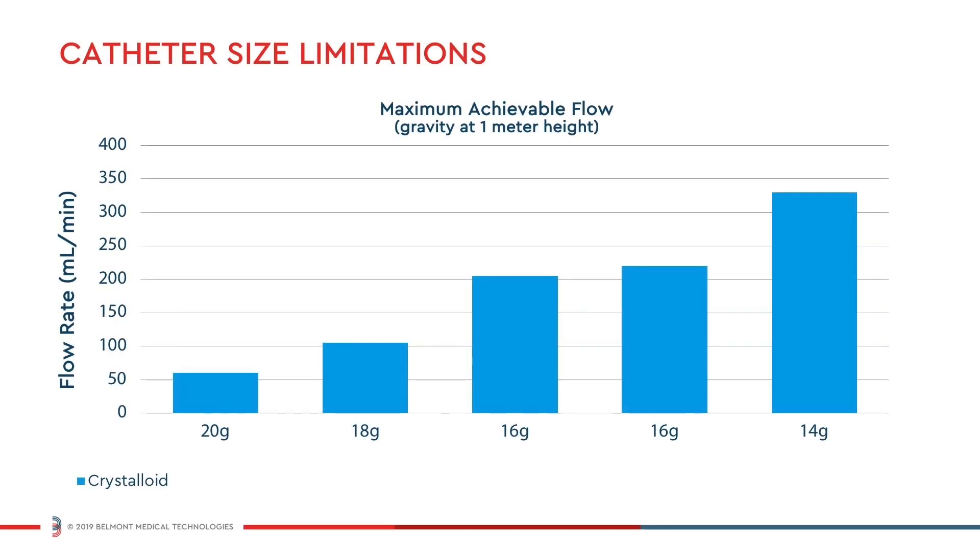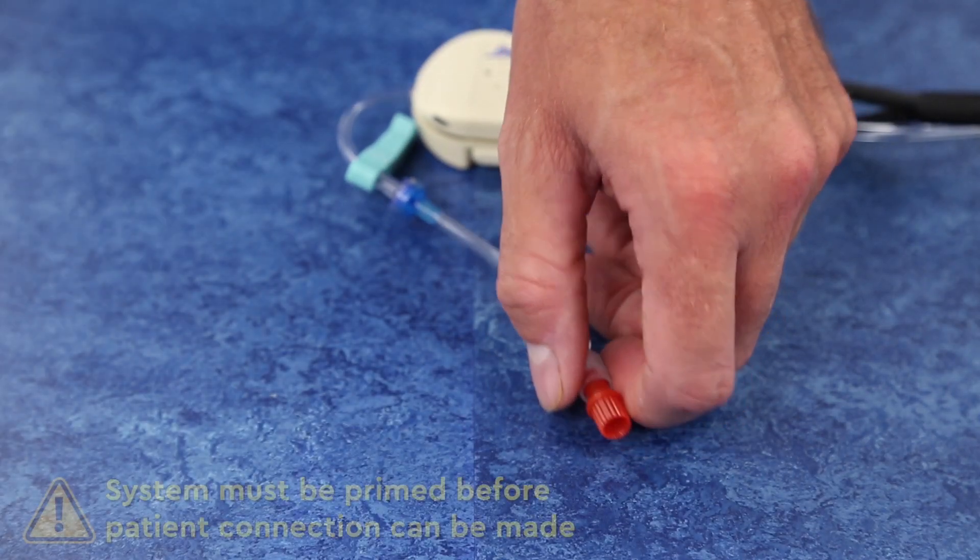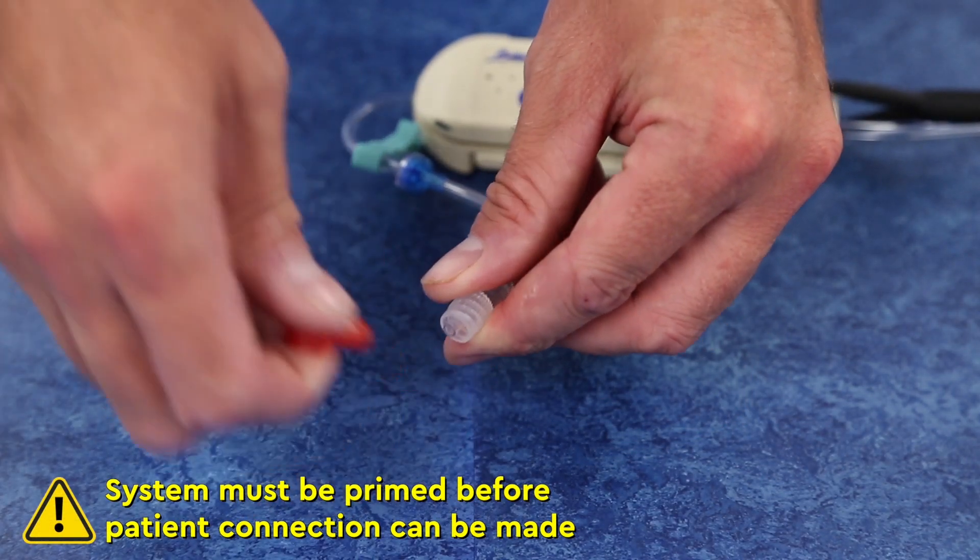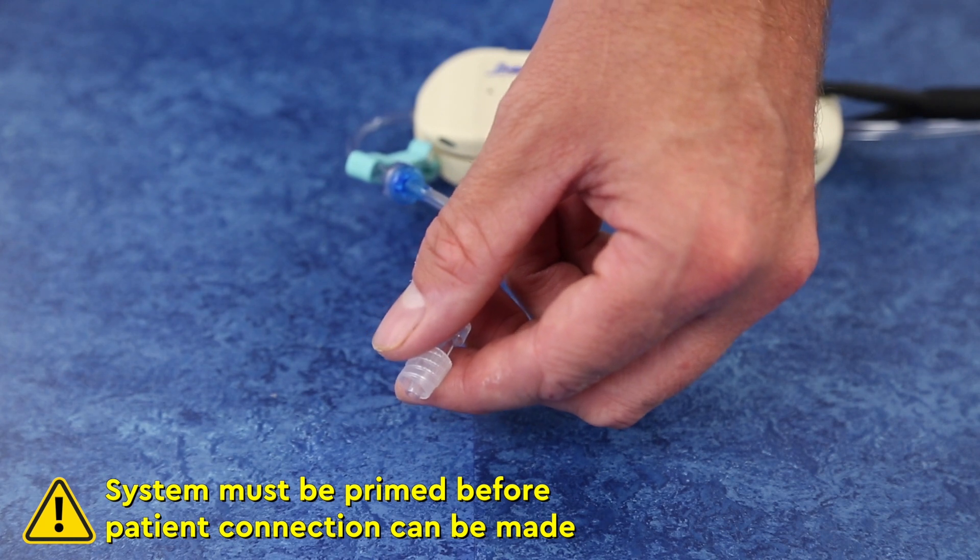To begin operation, first select the appropriate catheter size for the intended flow rate. Using aseptic technique, disconnect the red lure cap and connect the buddy disposable to the patient's catheter.